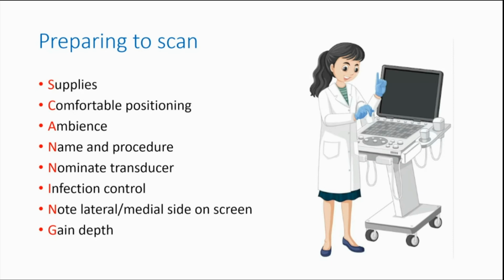Infection control needs to be taken care of. And we should always take note of the lateral and medial side of the screen, identify before we attempt any needle puncture, and consider attaining the optimal ultrasound image by the five functional keys as mentioned earlier.